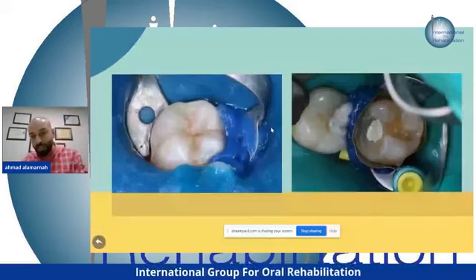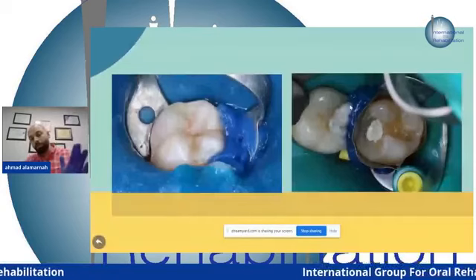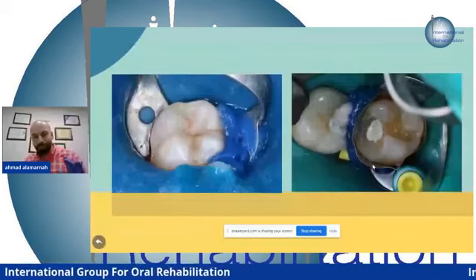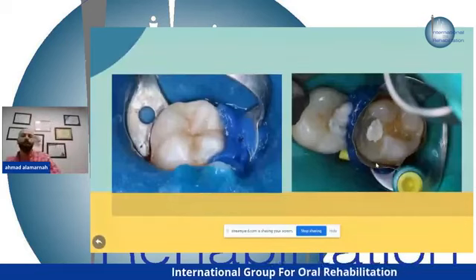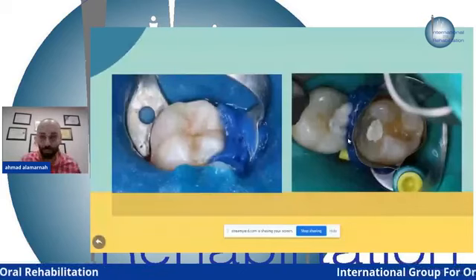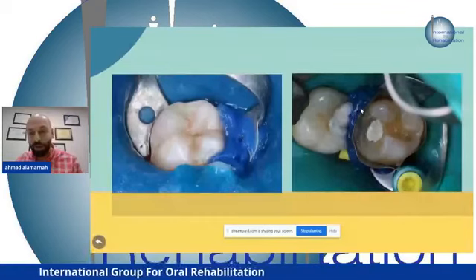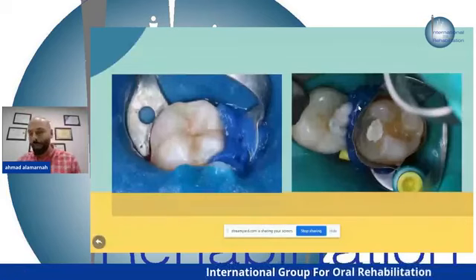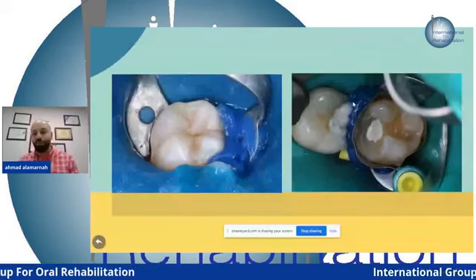And in the second picture, I use the liquid dam as a custom wedge. I use my instrument to compress the ring and the matrix system here, which is, I think, Opti Matrix from Kerr, or Pro Matrix, something, I don't know the name, because I spent the last 2 months at home. Okay, so I put the liquid flowable composite and cure it to create a custom curvature for this tooth.